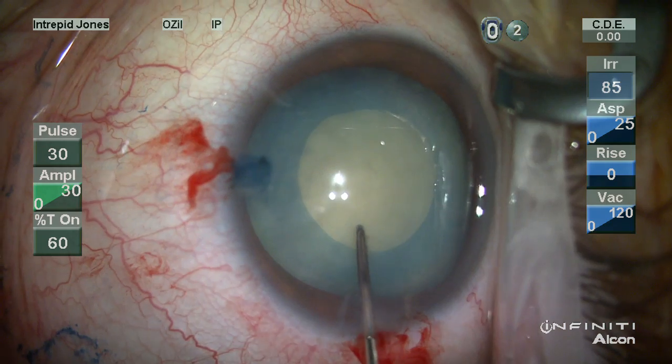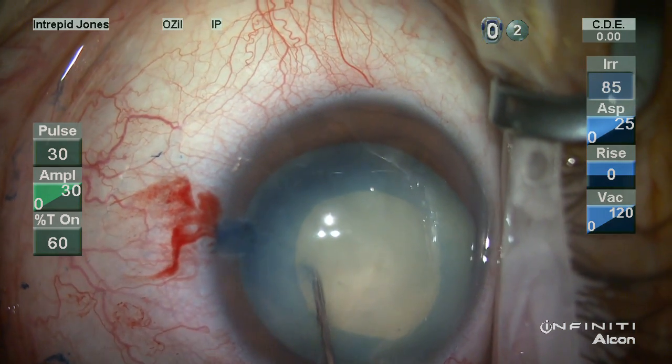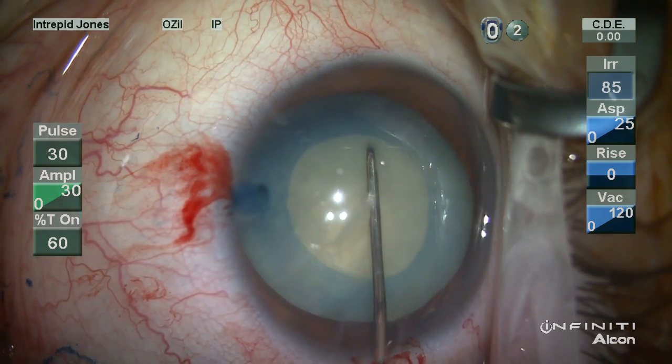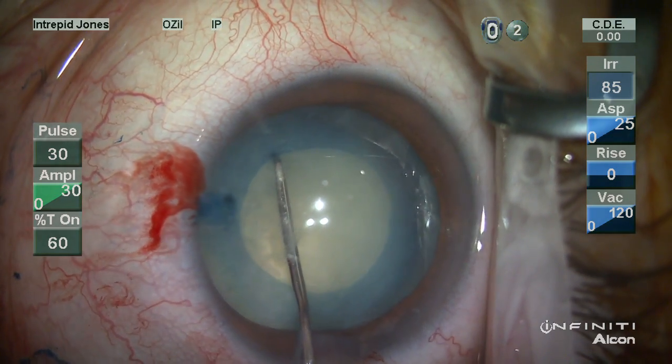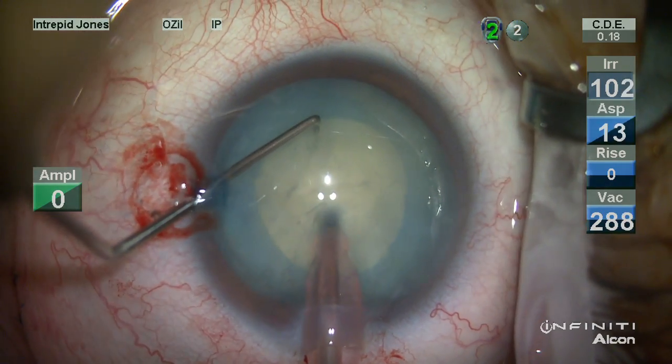As would be expected, the anterior capsule is stained with vision blue. There's very little hydrodissection that's actually done. Most of these white cataracts actually rotate fairly easily with minimal dissection.